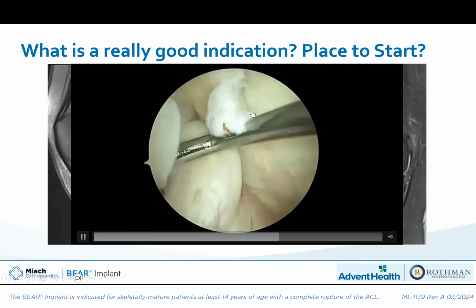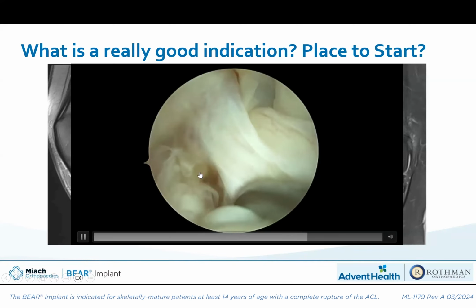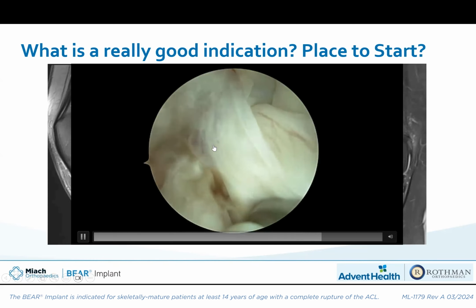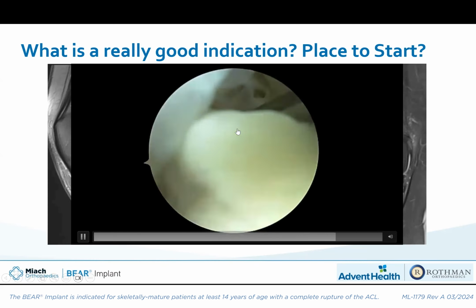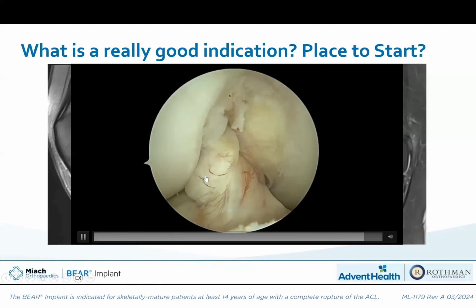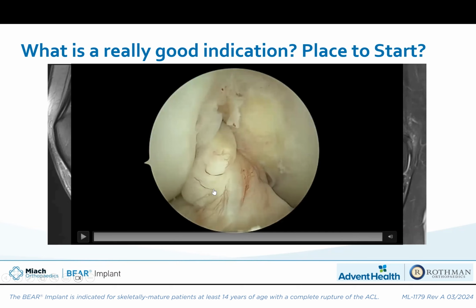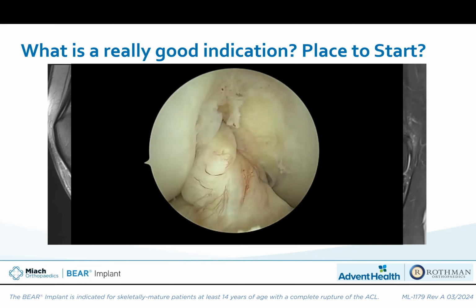And if I press down on that hole, you'll see some of the cyst formation tissue or fluid coming out of that area. So you can see some synovial tissue, but the bulk of the ligament is getting pulled off as I retract it back. So in a lot of these cases, this won't necessarily always heal to the footprint. So a great patient as we start off from an ACL restoration perspective.